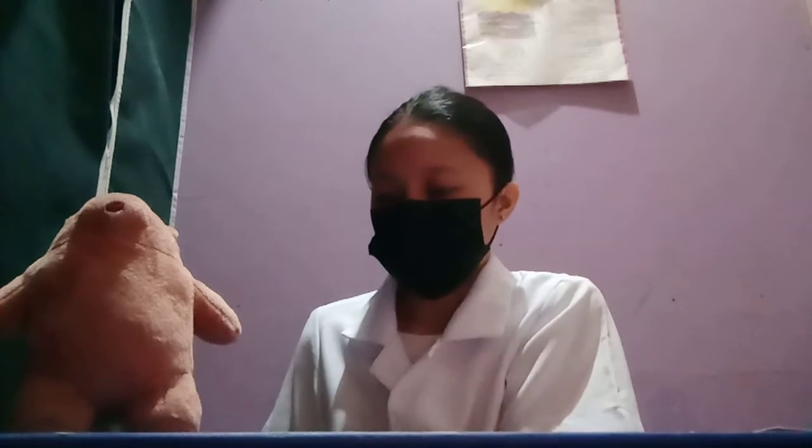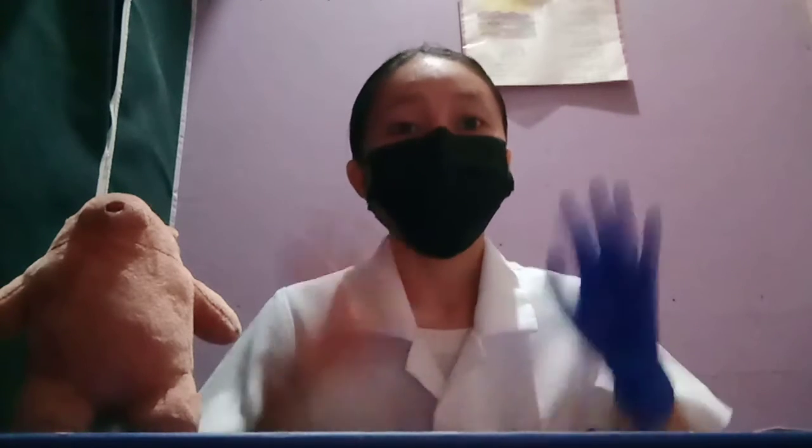First thing you want to do is protect yourself by wearing your laboratory gown, your face mask, hair nip — which I do not have, so let us just assume I have one — and of course the gloves. Apologies because there is some scarcity of gloves here, so let us just assume that I'm wearing gloves on both of my hands.